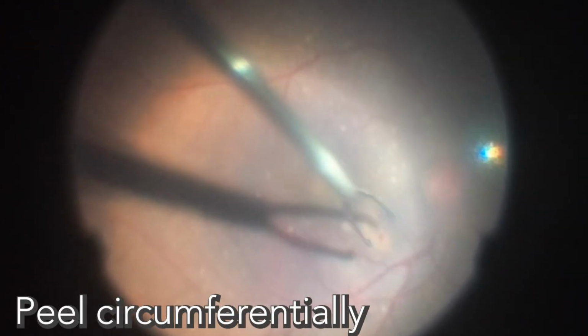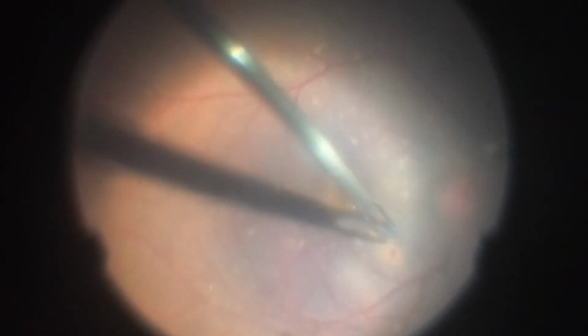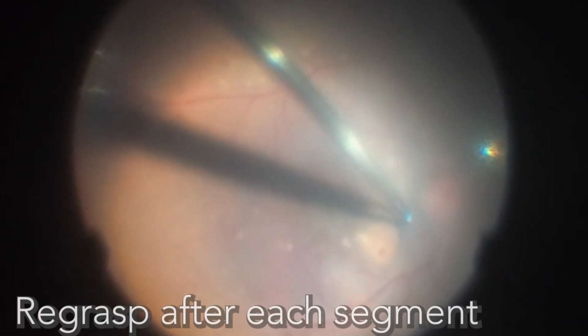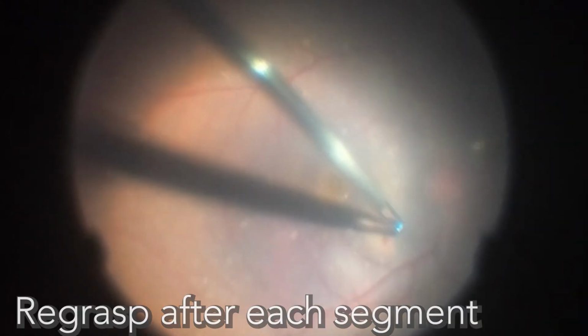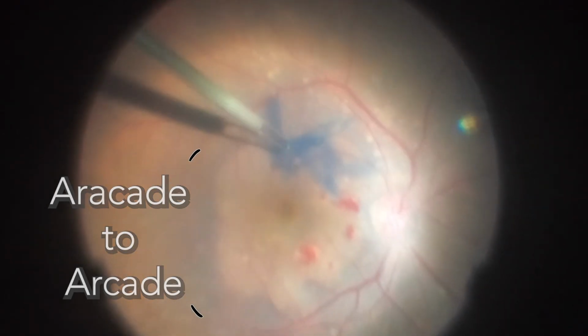Once raised, the ILM should be peeled circumferentially, grasping near its base. To prevent detachment, it's crucial to re-grasp near the base after each peeling segment. A peel from arcade to arcade is the most preferred.